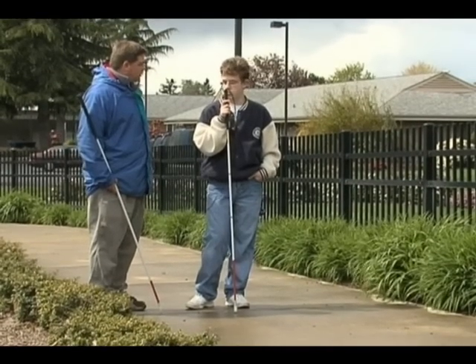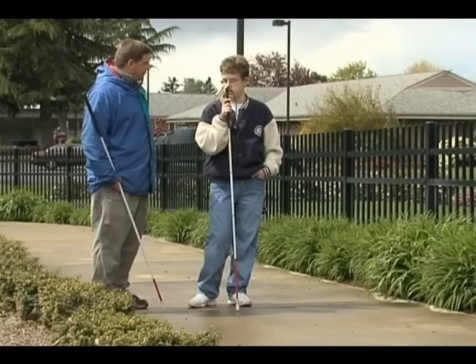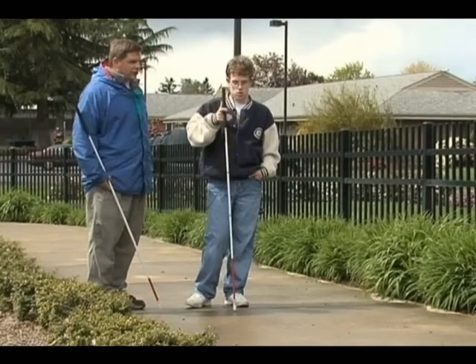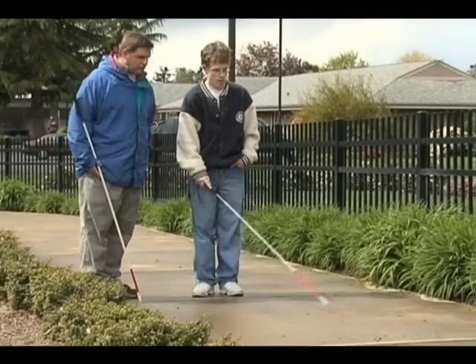It could also tell you sometimes if you're approaching an intersection — if you're looking for a down curb. Yes, it could. Okay, go ahead and show us that and see if you can find a change in the sidewalk.